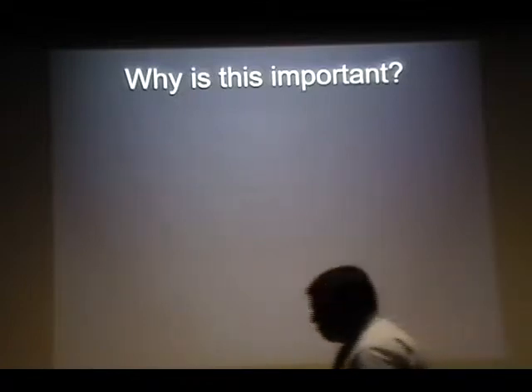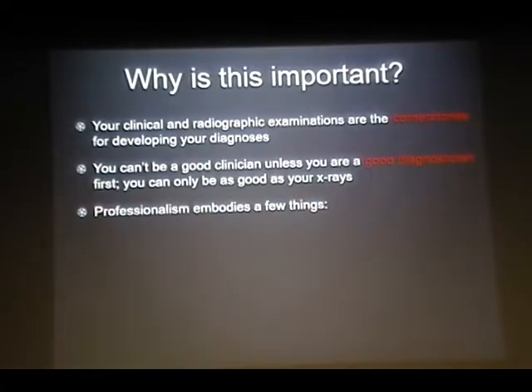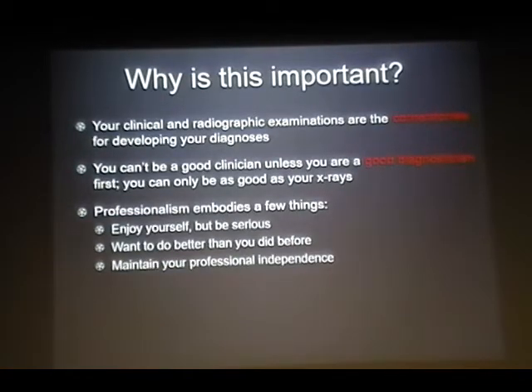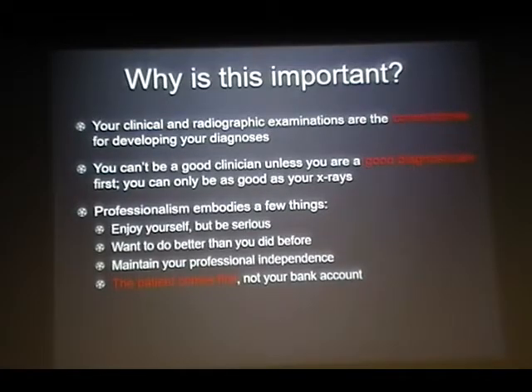Sometimes, if you diagnose on a non-diagnostic radiograph, you could end up in medical-legal problems. Please, if you are in doubt, take one more radiograph and try to evaluate. Don't look at the non-diagnostic radiograph. Why is this performance criterion really important? Because that's where your crux of diagnosis is concerned. Based on that, you are going to treat.